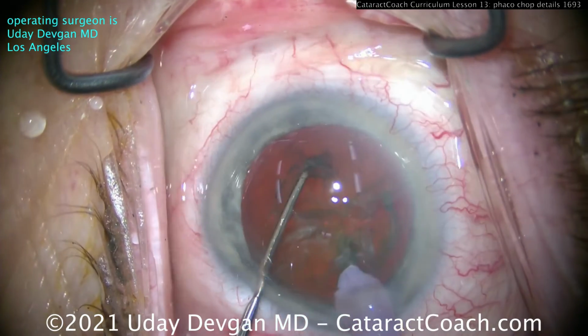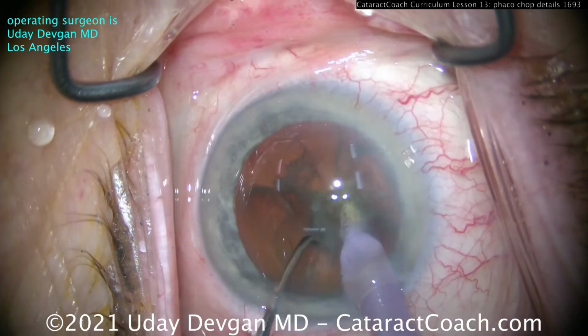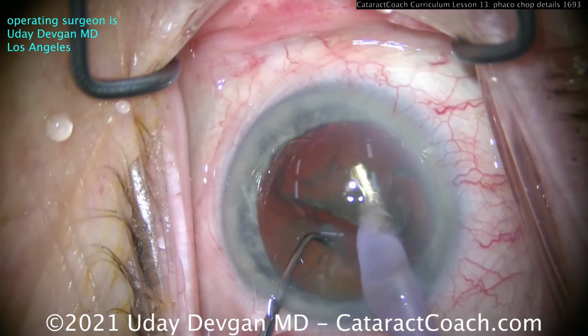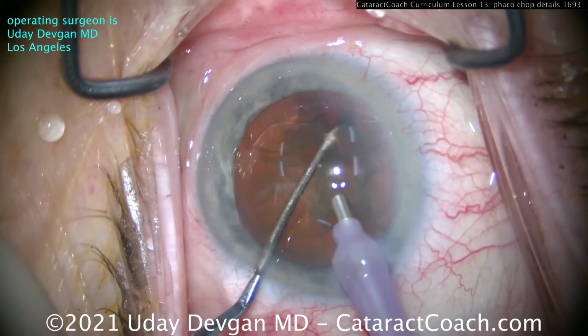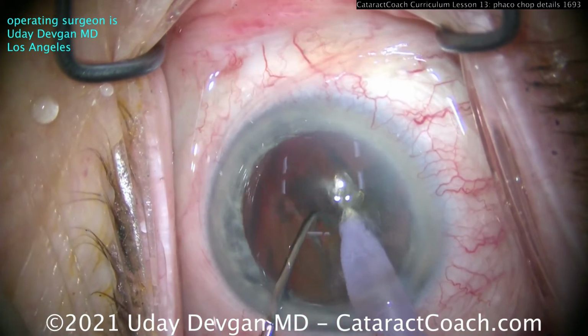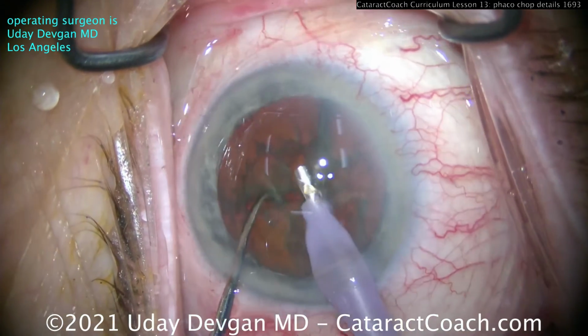Watch carefully, not under the rhexis, within the rhexis. Bring the instruments together and apart. And now we've achieved a nice chop. Two halves are created. Now rotate the nucleus, and here we can do it again. Buzzing in, chopper goes into the nucleus, and just separate them out.